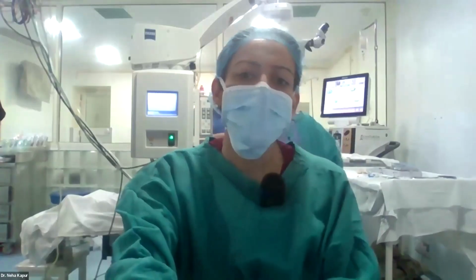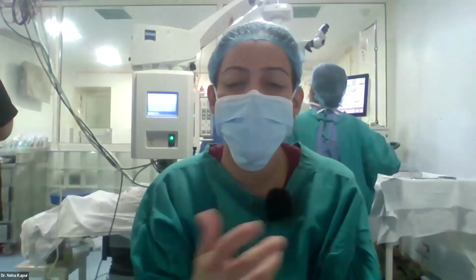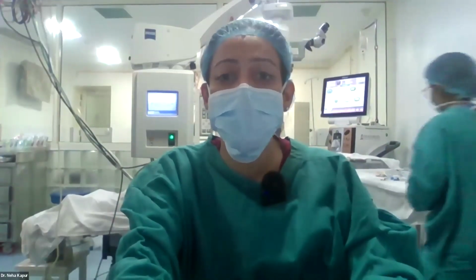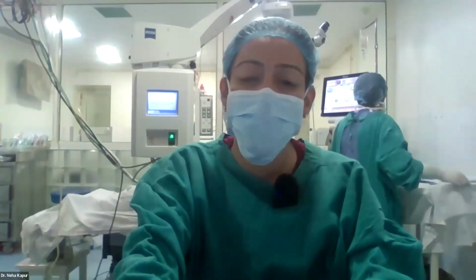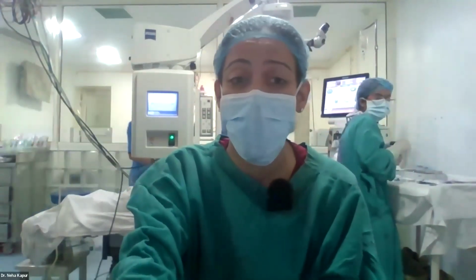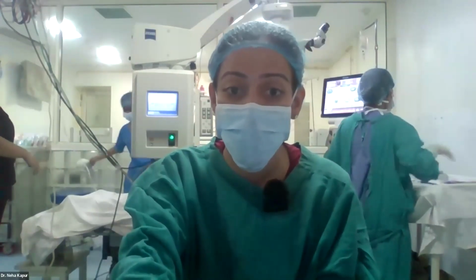Is a BCL used? So BCL is usually a personal preference. As protocol we don't use a BCL on the eye, unless the patient is extremely symptomatic, then maybe next day we can use the BCL on the eye. But our first choice is not to use a BCL because steroids and BCL make a bad combination. So we are not proponents of using BCL post-procedure.